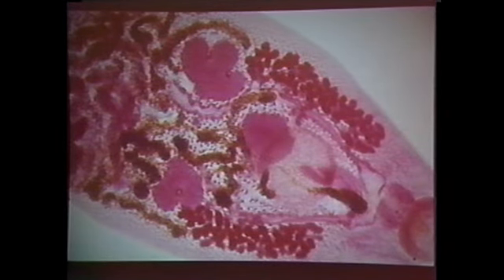Trematodes. Trematodes are very difficult to find the genus, and definitely species, in tissue sections. The trematodes have vitellaria, which are yolk-producing cells, usually on the periphery. They have intestines, they have testes, they have ovaries, and they have suckers, and then they have uteri that are just filled with eggs. They have a solid parenchyma, which is like a sponge, so you don't see any of that pseudocoelom or coelom like we've seen in the others. And this is a cute little thing.